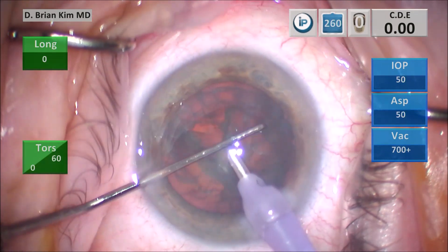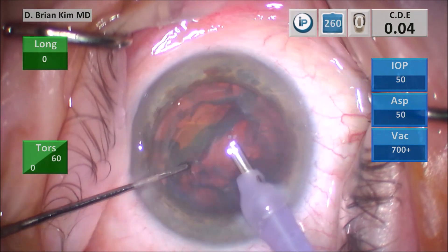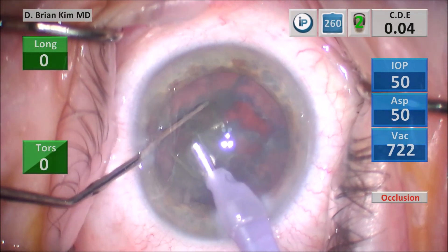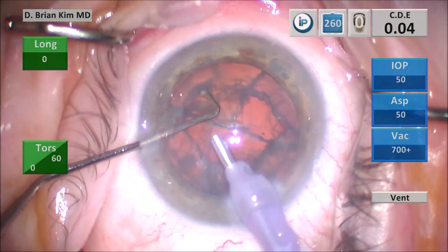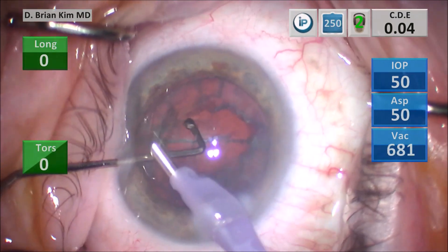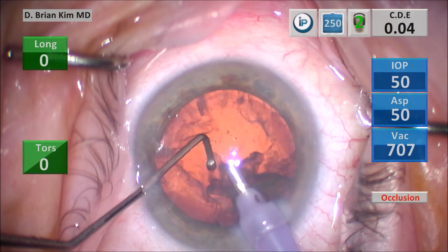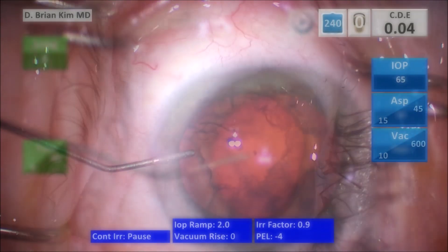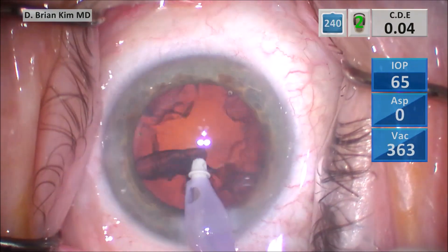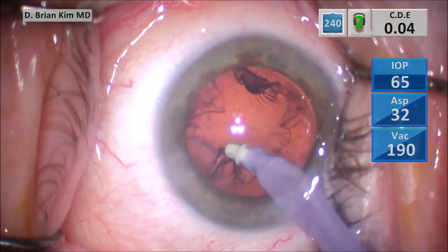I place the chopper around the second quadrant, pulling it up and emulsifying the lens piece. I turn the second heminucleus in front of me, place the chopper around the lens piece, crushing it towards the phacotip, then use the chopper and high vacuum to emulsify the lens pieces. You can see this is a fairly soft lens. Once all the endonucleus is removed, I remove the epinuclear material from the anterior portion first. I take the chopper out, push BSS in, take the phacotip out, and put in the I/A handpiece. I start sub-incisionally, sweeping side to side, making sure I get occlusion, and then teasing it — not just with high vacuum, but using mechanical forces. The teasing motion allows me a lot more control, as I can mechanically tease it off before I activate that really high vacuum.